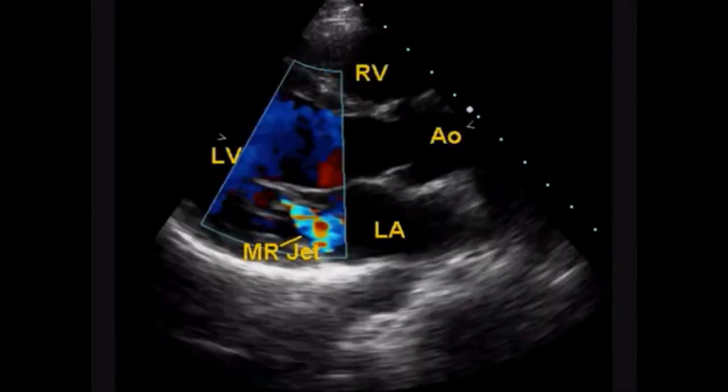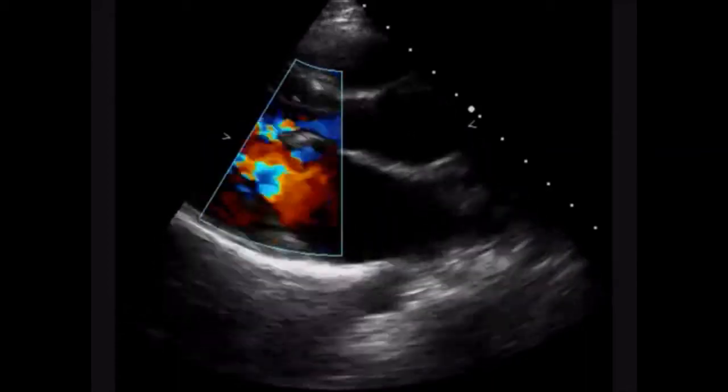Here the color Doppler jet — the MR jet, mitral regurgitation — is seen in the parasternal long axis view.